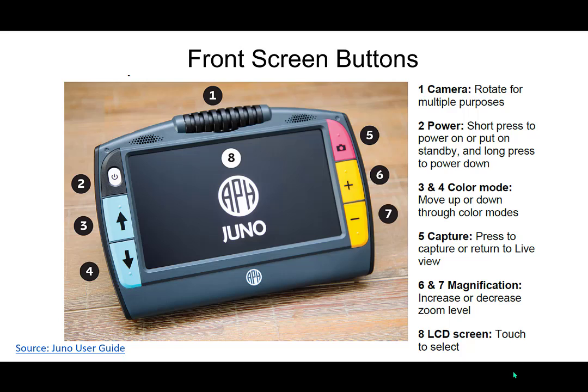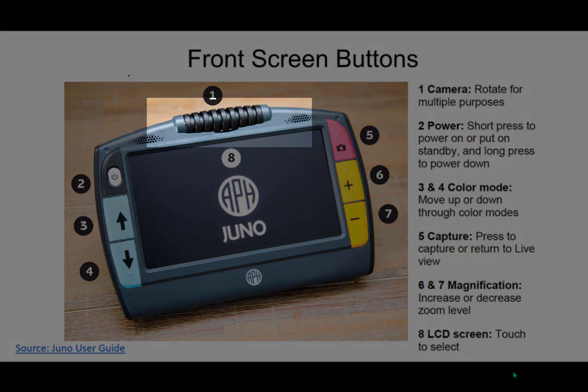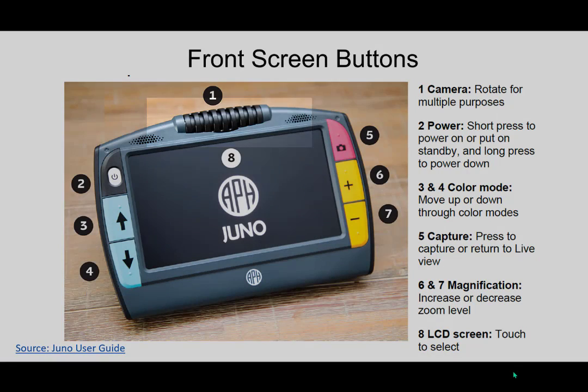So this next slide is an overview of the front screen buttons, and we're just going to talk about those very briefly, not necessarily what they do, and we're just going to orient to the unit a little bit. So if you hold the unit with the screen facing you and the buttons facing you and the rotating camera facing in the up position, we're just going to orient to the unit a bit. That rotating camera, that barrel camera, is what we were talking about earlier. You'll see that it rotates towards you and away from you.